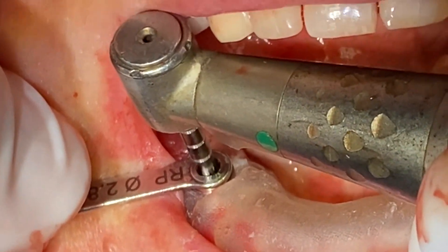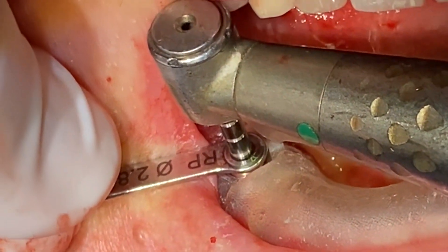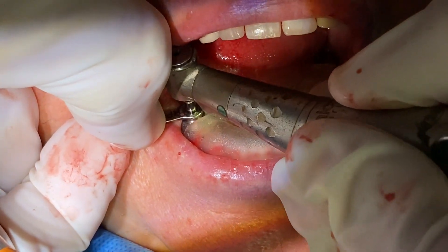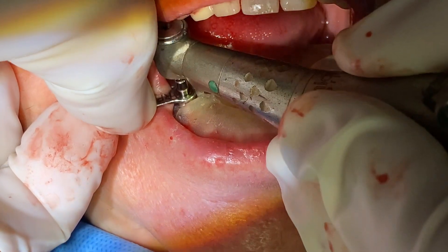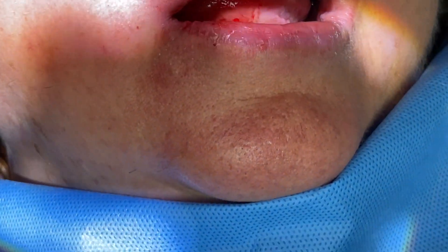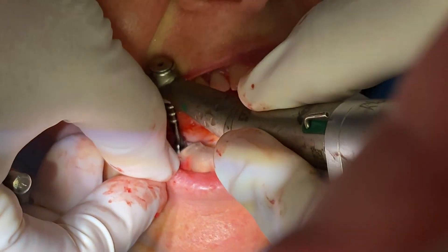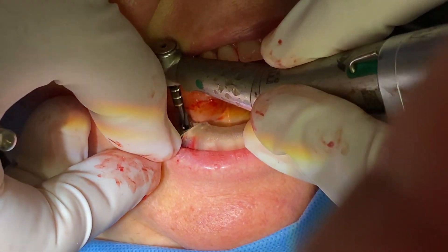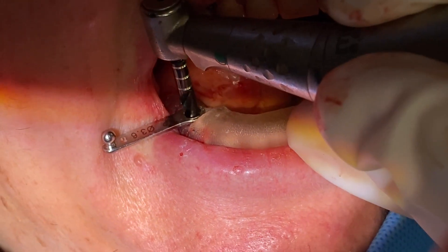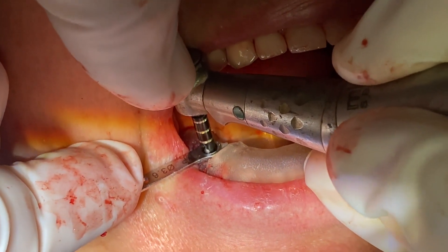As we drill, we're going very slow — at about 50 RPM. I used to drill at about 800, and I've switched to a much slower RPM but also using very, very sharp drills. By doing so, we're cutting the bone, and you can actually keep the bone on the drill much better this way. As I pull the drill out, you'll see on these larger drills the bone is staying on the drill. If you need to harvest that at all, it's a great way to harvest, because when we're using a lot of rinsing and washing, the bone is actually being burnt, and also the bone is being lost into the suction. You can use suction retrieval, but that carries a lot of contamination into the graft area.